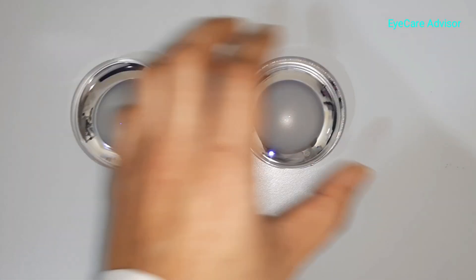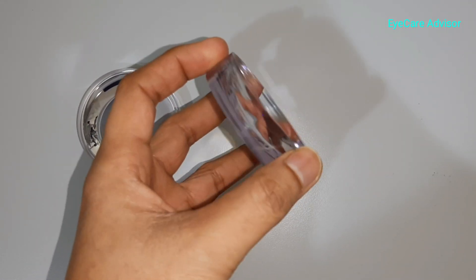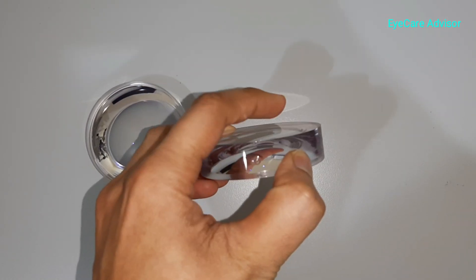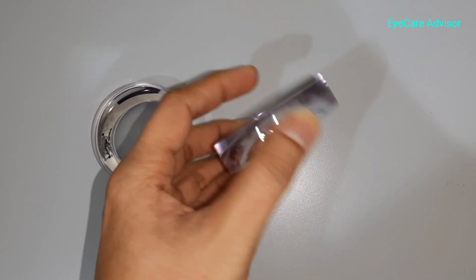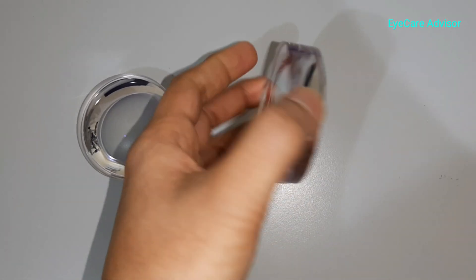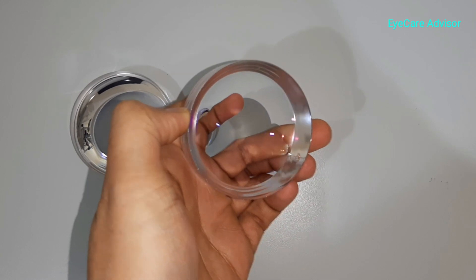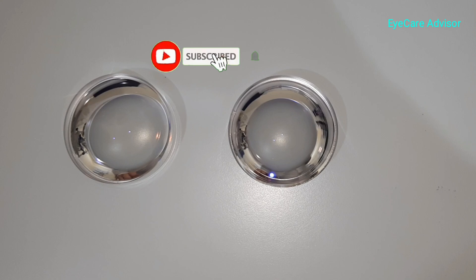This other lens is minus 17.5 — even higher power. These are both double aspheric lenses. You can see the front surface is totally flat. The central thickness is very very thin — you can see how deep my finger goes inside. With double aspheric lenses it will be thinner, lighter, and the quality of vision will also be much better.